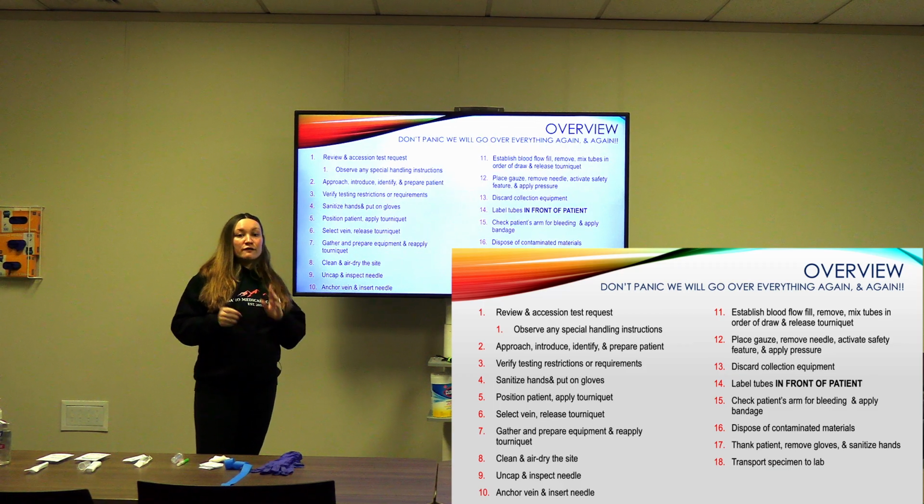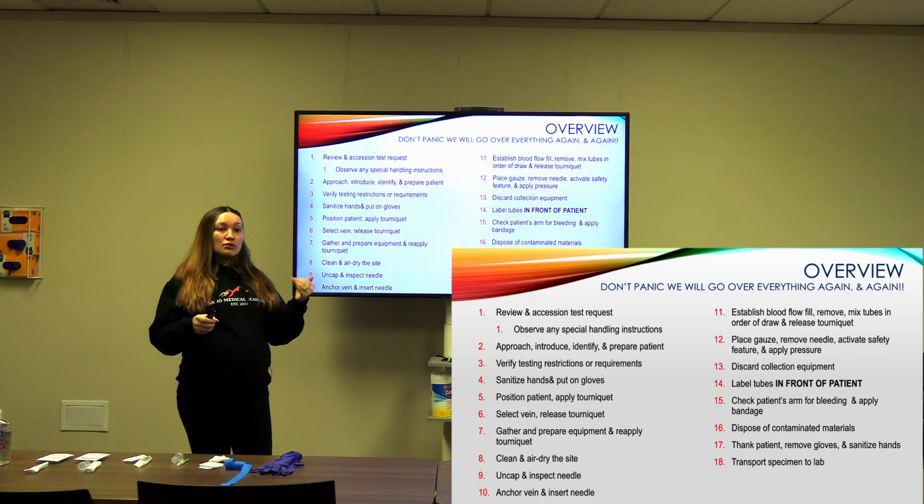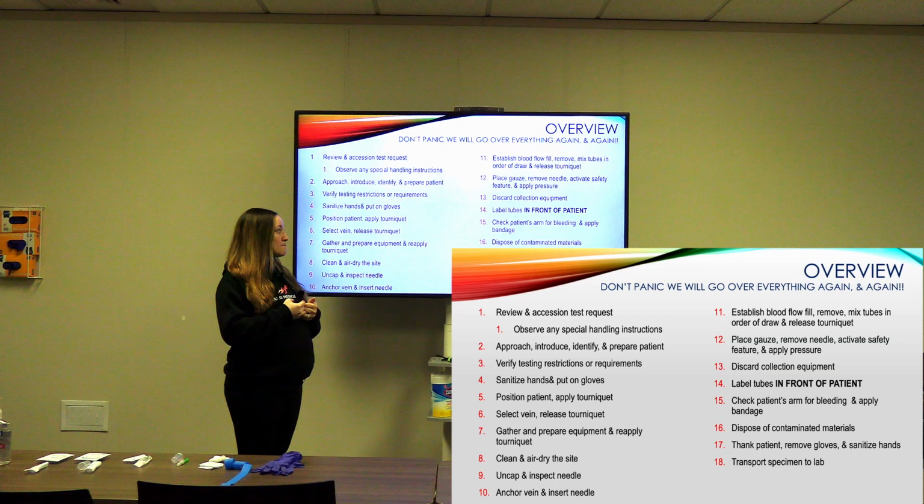All of the tubes that you've taken from this patient need to be labeled in that room so that the next room you go to, you already have the tubes from the previous patient labeled and there's no chance of accidentally labeling them incorrectly.